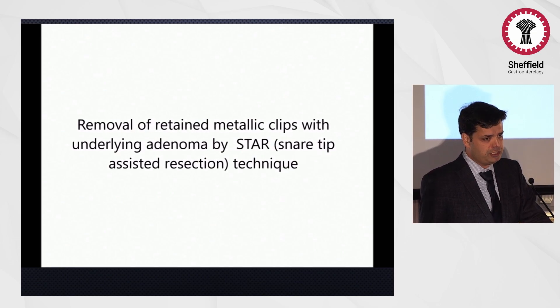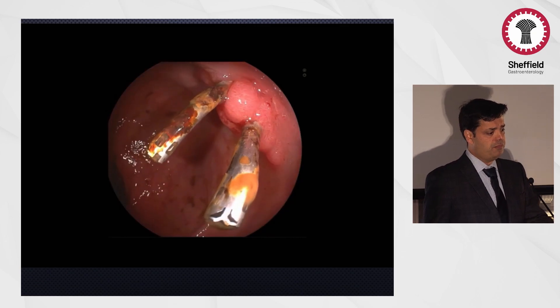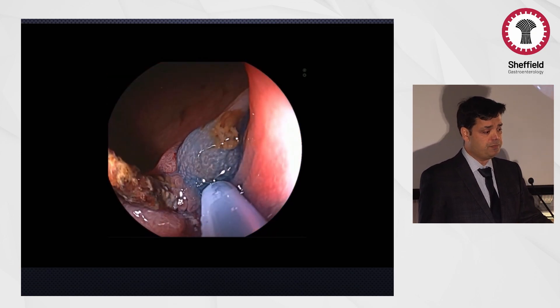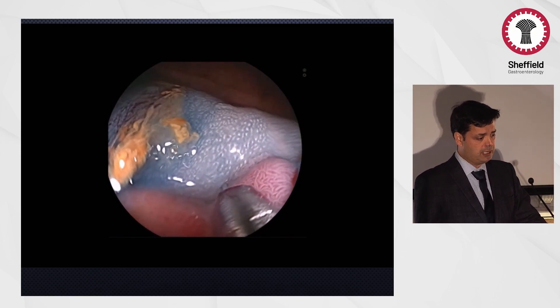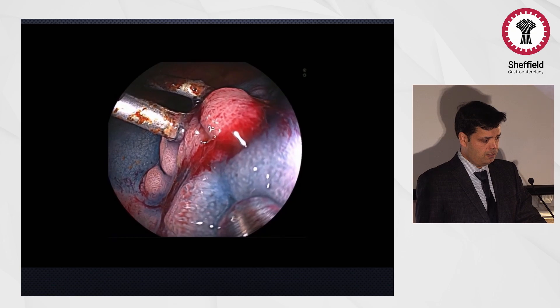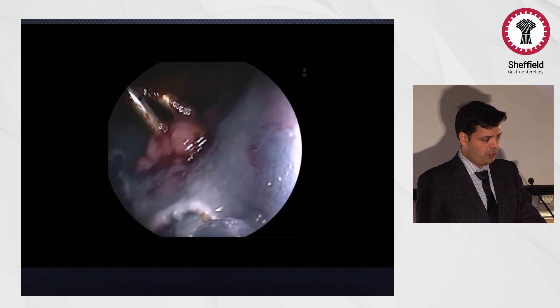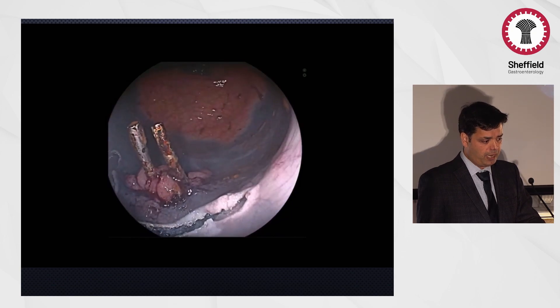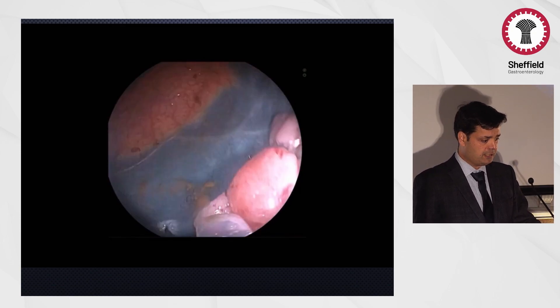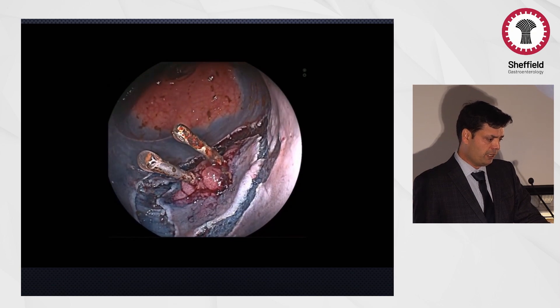This is another case — a very small polyp in the rectum. When it was resected, it was an R0 early cancer, but the previous endoscopist had put two clips in. Four months later, another polyp had developed underneath, which was completely benign, with the two clips stuck underneath it. The area was injected around it, and using the tip of the snare to make a bit of a groove. This was confirmed to be low-grade dysplasia by biopsy beforehand, so the aim was to resect it — and it looks like I managed to get it in one piece.